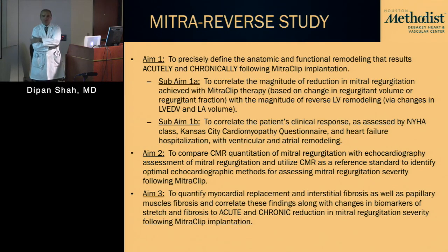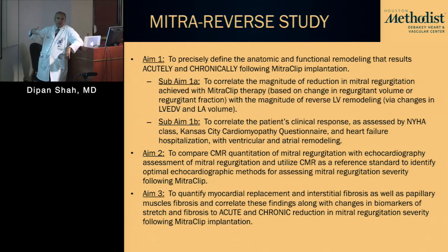Okay, yeah, Dale? With this T1 sequencing, in terms of conditions like diastolic dysfunction, where there may be a progression of fibrosis, could it be used to monitor the progression of that? Right, so that's a very good point. Because if we think about it, when we measure diastolic dysfunction, what we're measuring is probably the end manifestations of fibrosis.